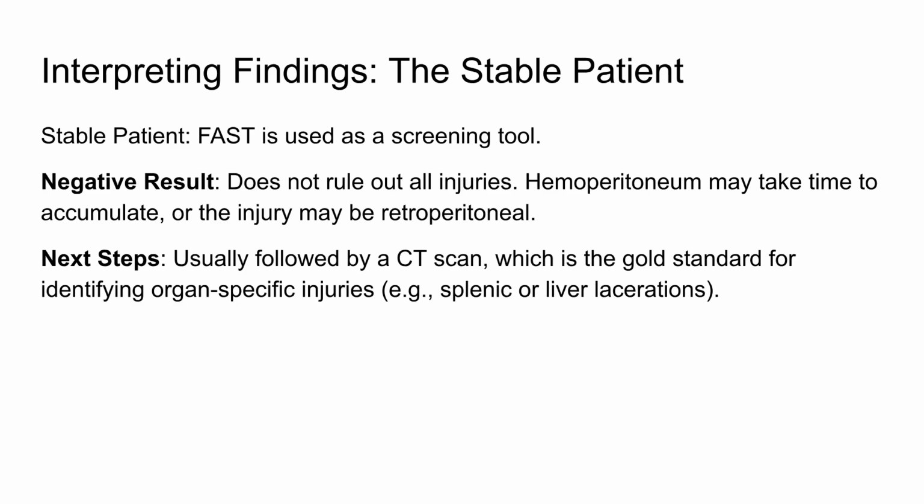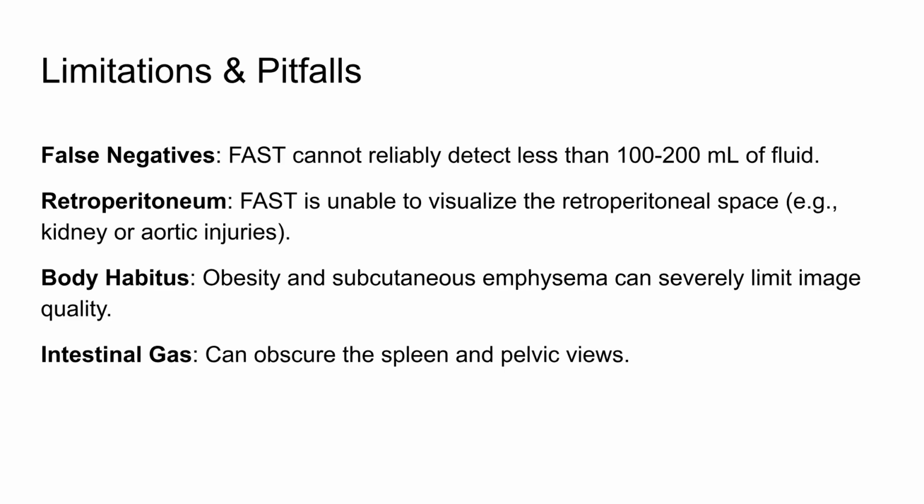For the stable patient, FAST is a screening tool. A negative result doesn't rule out all injuries, as hemoperitoneum may take time to accumulate. Next steps usually involve a CT scan for organ-specific injuries.